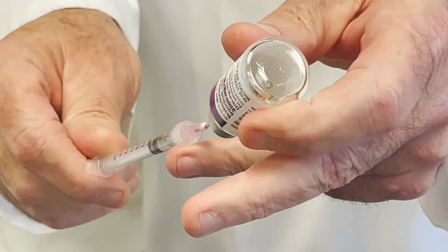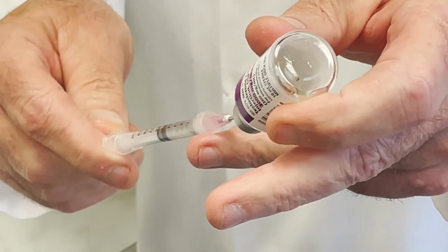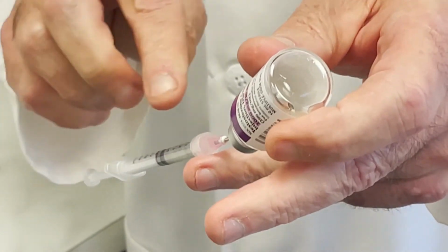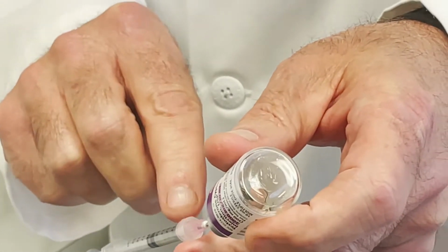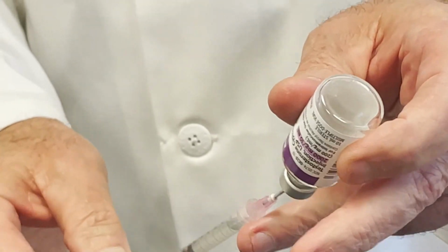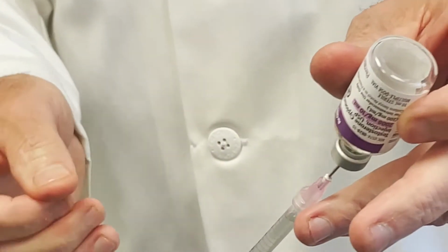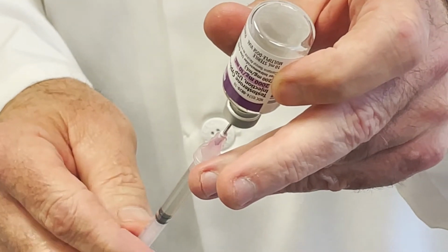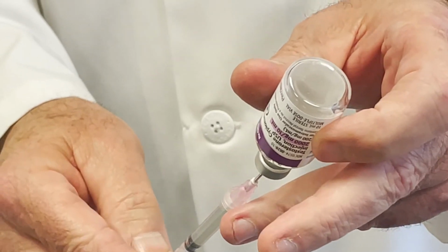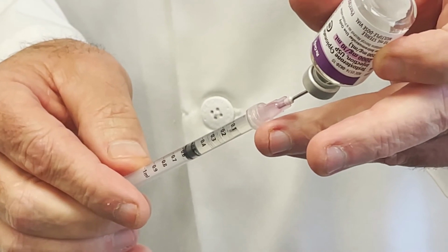For today's demonstration, we're going to be preparing a 0.5 cc injection. So as you see, we're at the 0.5, but we still have air here. I generally pull this back to about a 0.7. The air is still located at the top because of the position. I tap on the syringe to get rid of any air bubbles that might be in this position. Slowly push this out to 0.5 mils.